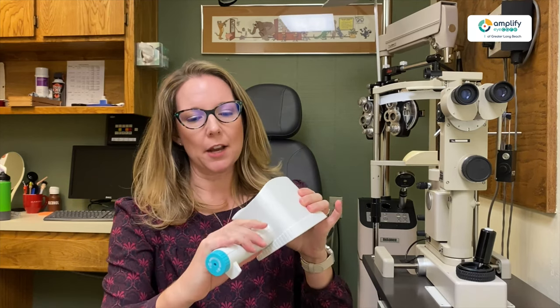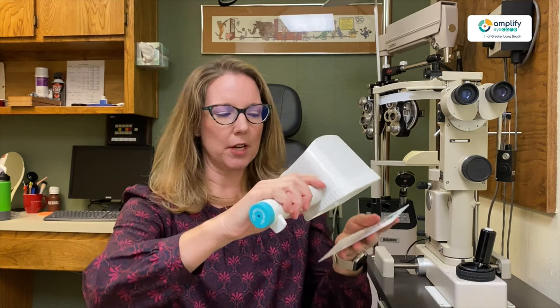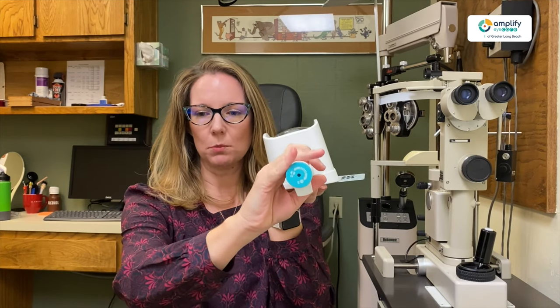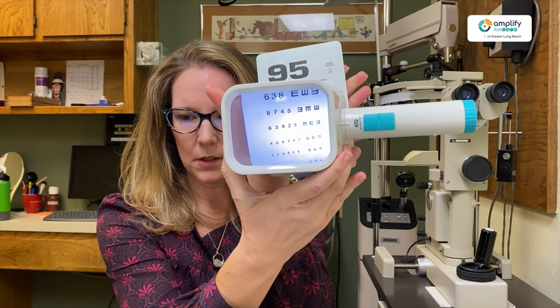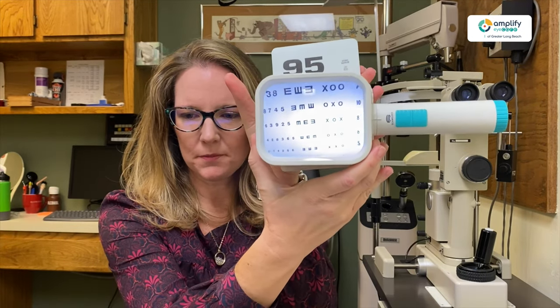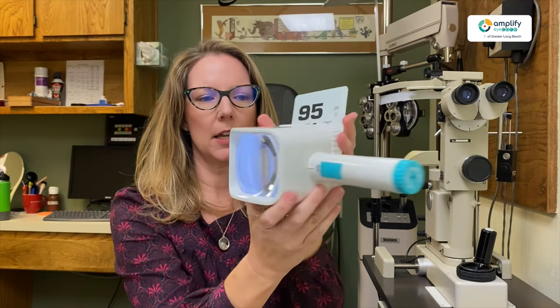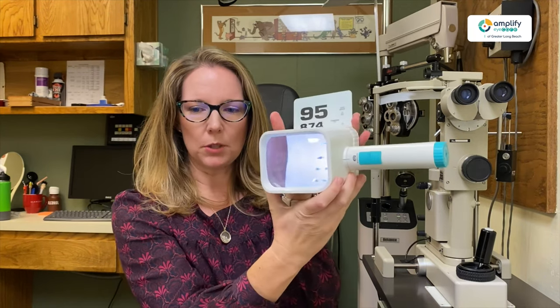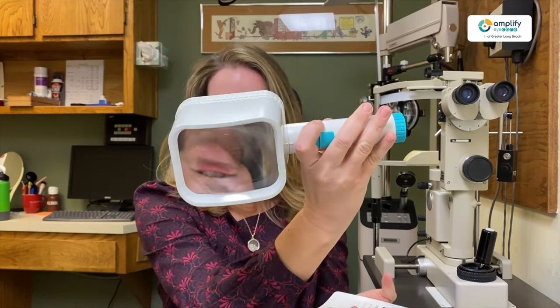That's versus when you have a stand magnifier. What that will do is actually sit on the page itself. You still have it in your hand, but ideally you would have it on a table or something and then just move it along. So that allows you to have that smoother reading when you are reading, say, a newspaper on a table, and you still have a nice big window.